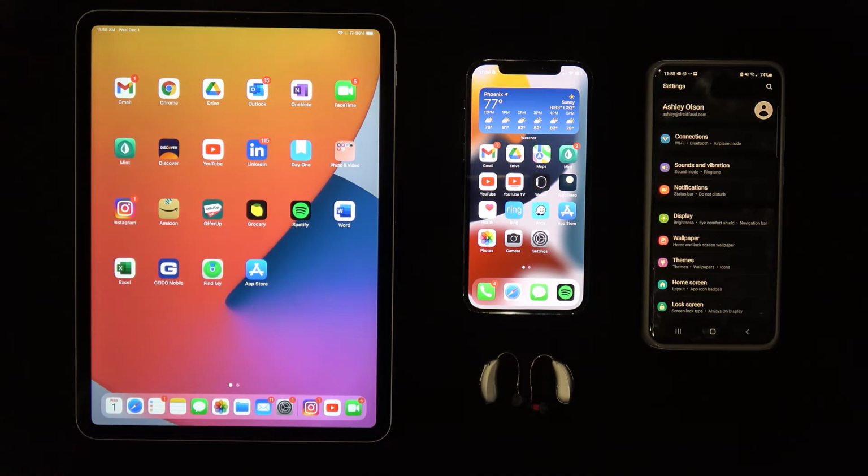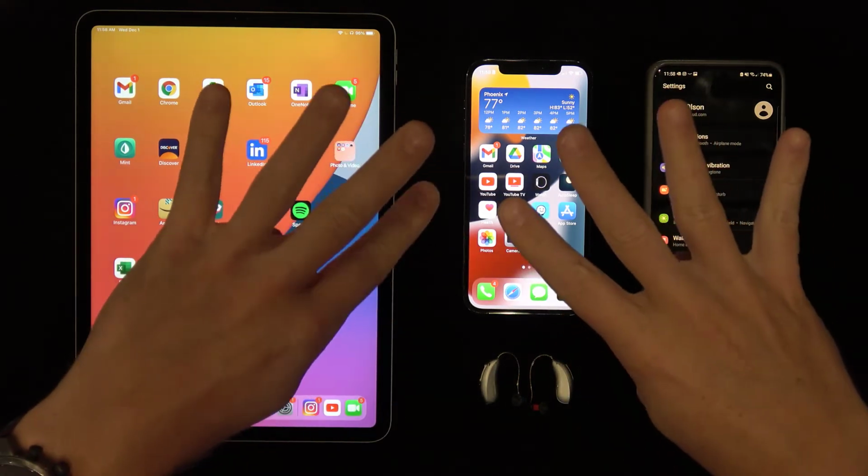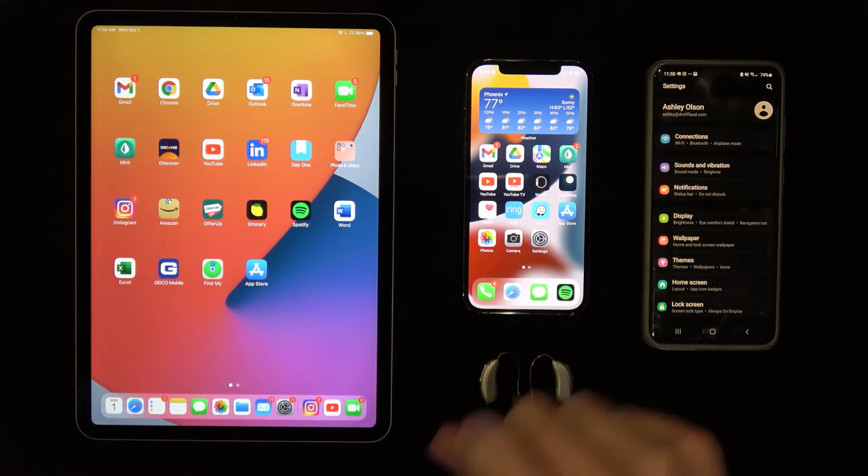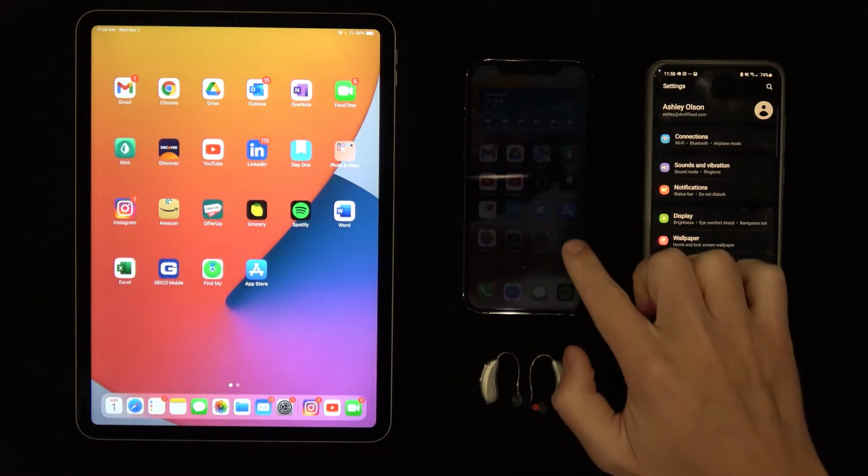Since Paradise hearing aids can be paired with up to 8 different Bluetooth devices, we already have paired these hearing aids with all 3 of these different Bluetooth devices. But since Paradise can only be actively connected to 2 of these devices at any given time, I'm only connected to 2 out of these 3 devices.